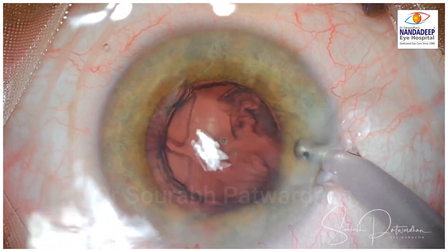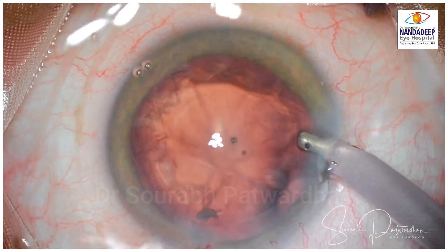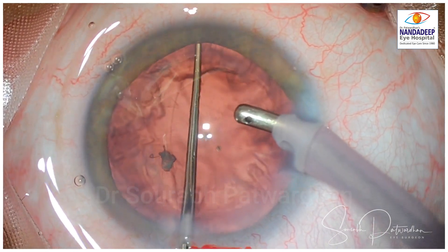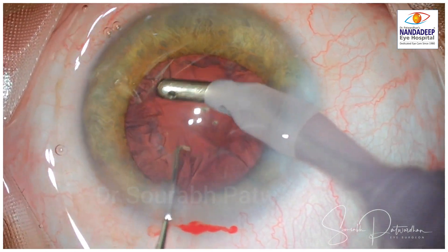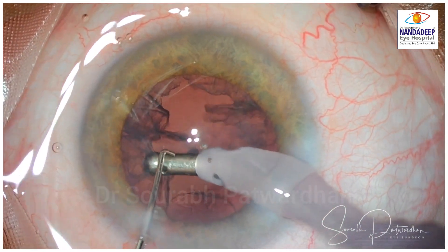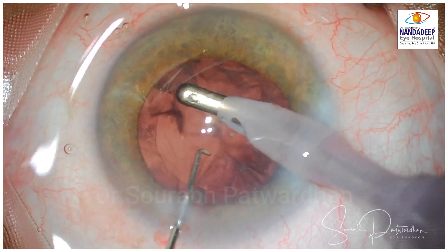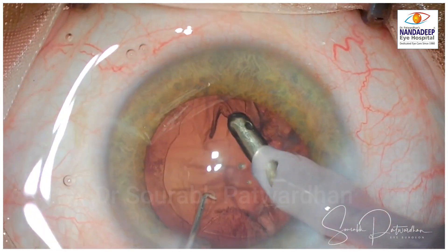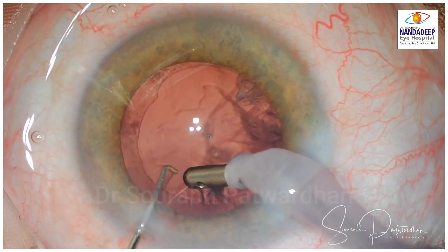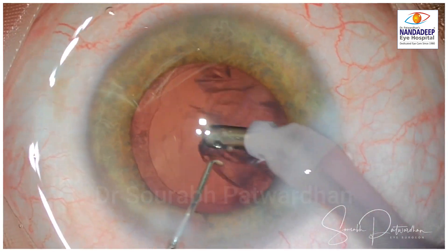Those little fluctuations are because of reduced scleral rigidity which is seen in myopes. As you can see here as I insert the probe, the AC deepens showing lens iris diaphragm retropulsion. For cortex removal, just pull the cortex little bit posteriorly — that makes it safer.